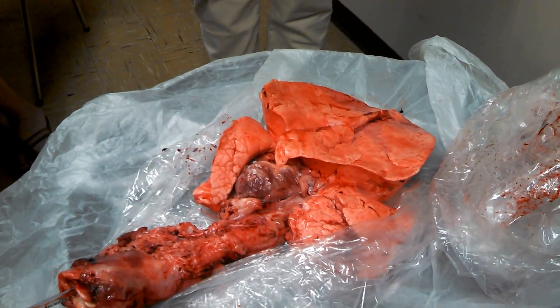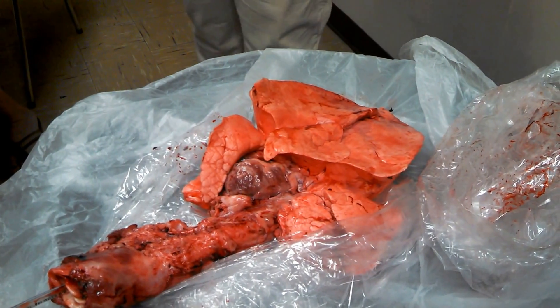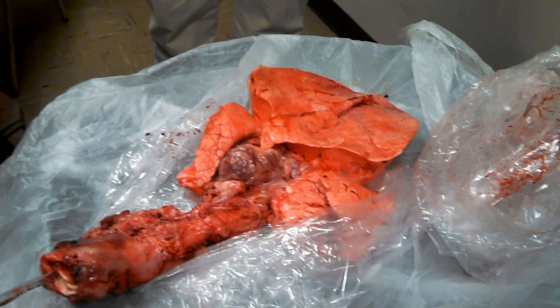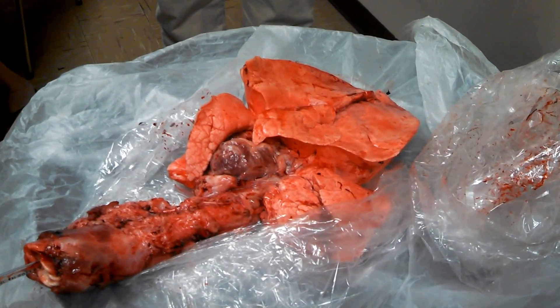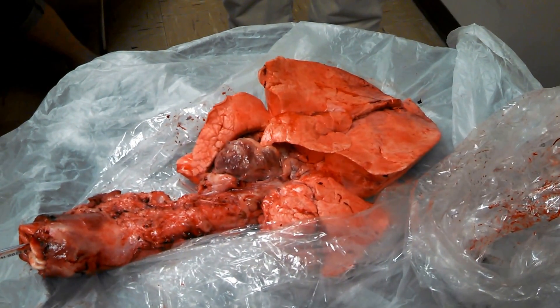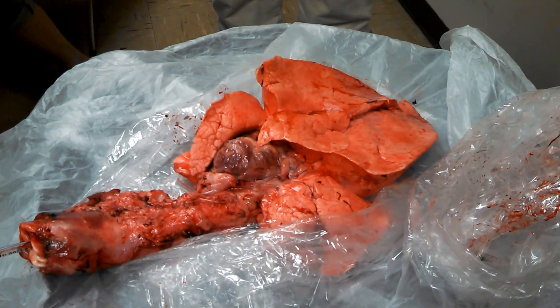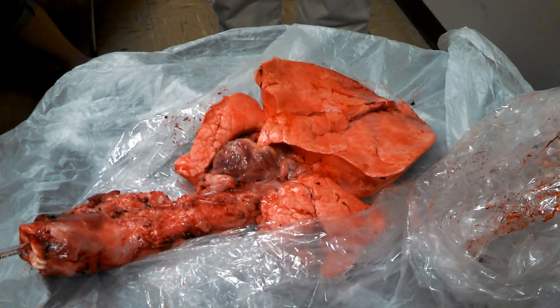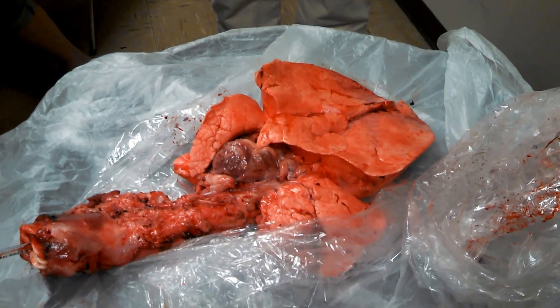We had the exact same settings, we dropped the PEEP to 0, and we de-recruit most of our lung tissue. Now we have an I to E right this second of 1 to 4, which is still good.